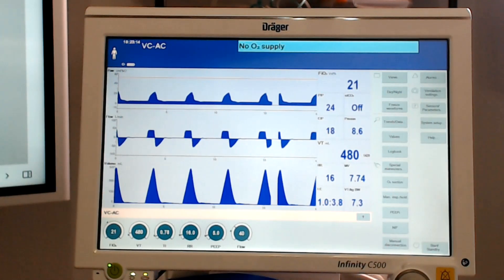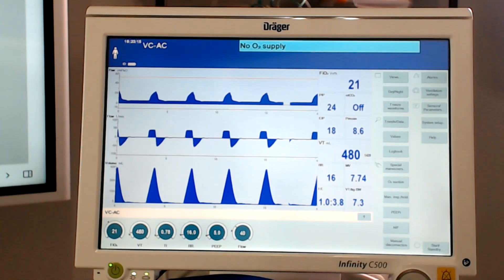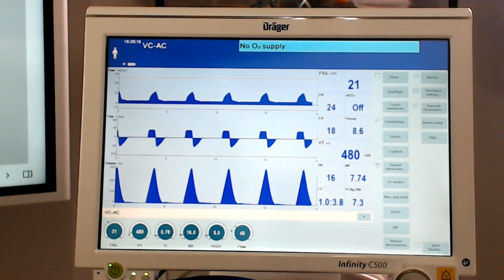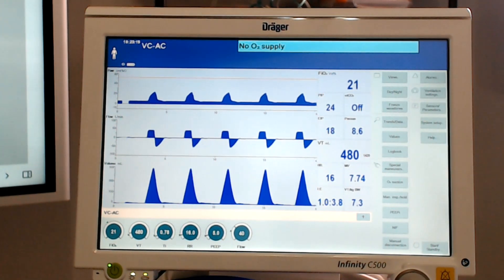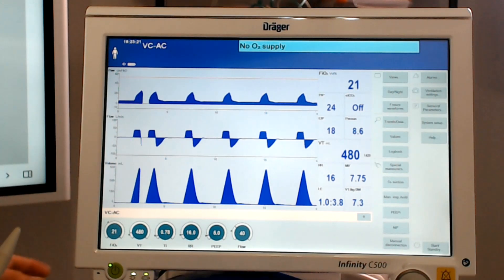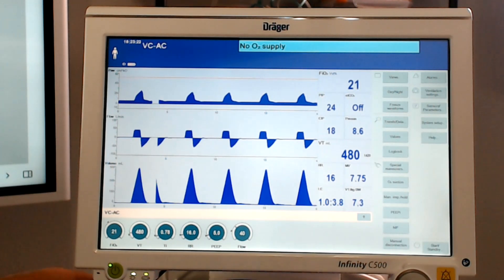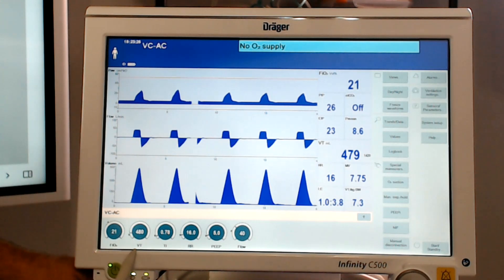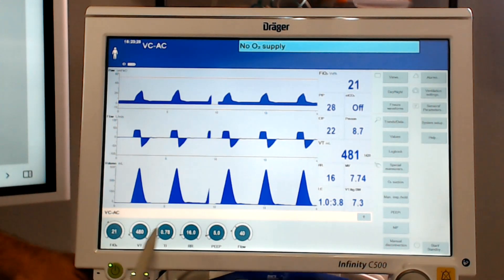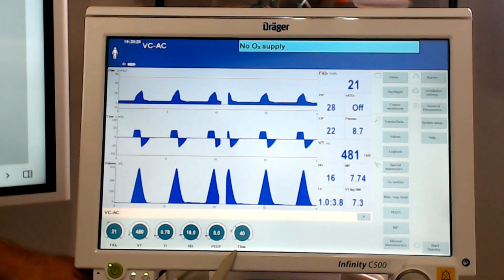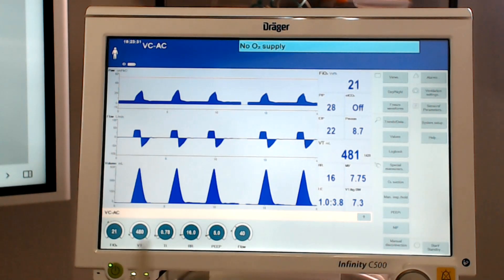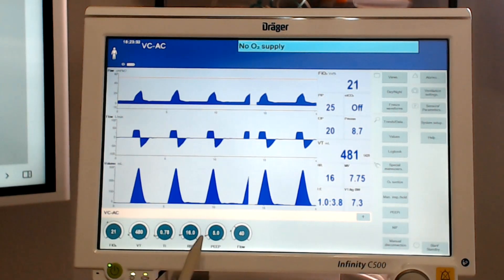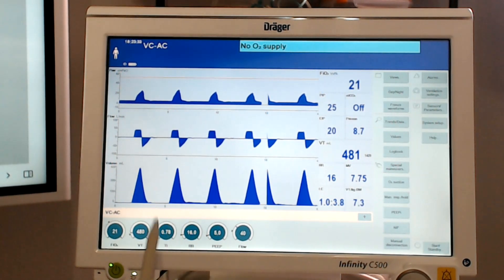We're going to get started here talking about volume control. There are some elements here that I want to point out that I want to make sure you understand. First things first, if you remember when we are in volume control, we know that we have a tidal volume set. We have a flow set. These settings establish an inspiratory time.